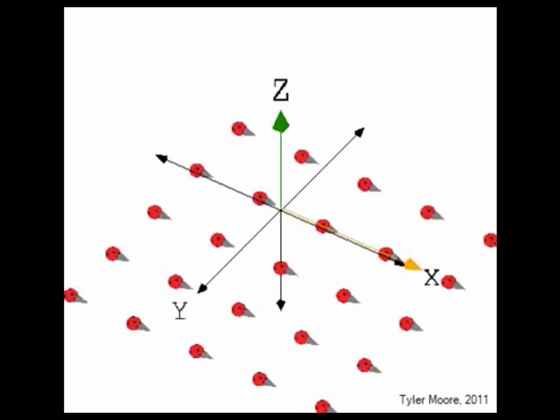What will happen is initially, when the protons get excited and go into this high energy state, they're all marching in step together. But over time, because of the little differences in their microscopic local environments, they will march along at slightly different rates and essentially get out of phase with each other.